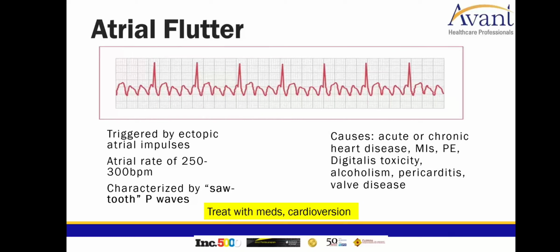Like I said, similar to AFib, this cardiac rhythm is originating from one foci, F-O-C-I, we call it one focus, or one cell. The gatekeeper will prevent the other signals from getting through. Notice he is not going to let every impulse go through, otherwise your ventricles would be beating at 300 beats per minute. So it allows every fourth beat to go through. That's what we call a 4-to-1 ratio.